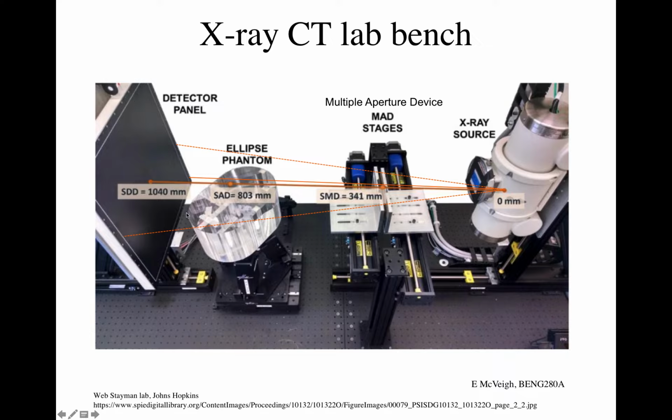This is an off-the-shelf X-ray detector that you would use in a fluoroscopy system or something like that. And you just set it up so that it's orthogonal to your X-ray beam. And this is the phantom that you're going to image. And just like the Hounsfield experiment, what you do is you rotate the phantom, right? So you have absolute control of rotating that phantom, and you create the X-ray image that way. And so a lot of X-ray imaging laboratories across the country have setups like this.